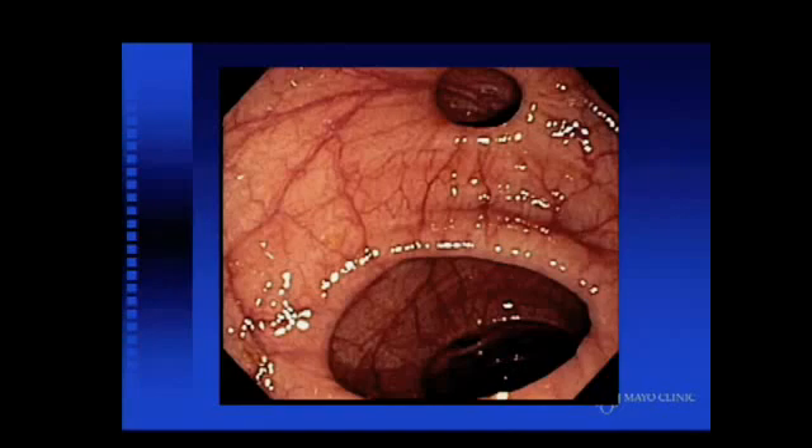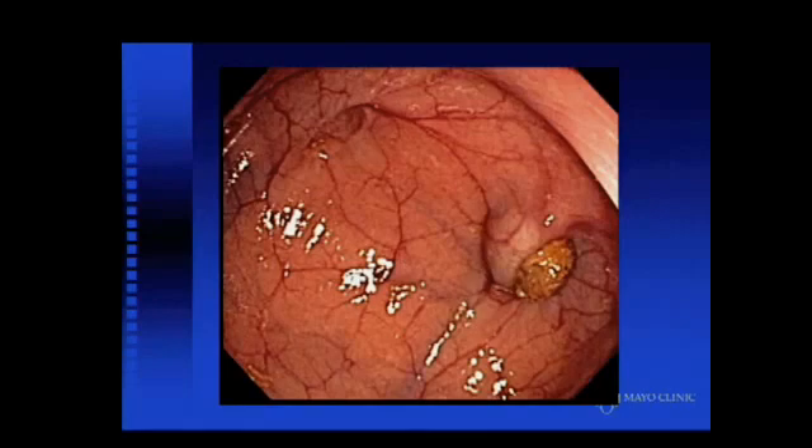In the sigmoid colon you encounter the first diverticula. It's important to stay with the lumen of the bowel and not try intubating the diverticula themselves, which can be difficult in a patient with multiple diverticula and a spastic colon where it's difficult to differentiate between the lumen and the ostium of a diverticulum. Stool balls within diverticula are almost pathognomonic for diverticulosis. A little bit of slide-by is acceptable as long as the patient is comfortable, but excessive slide-by can introduce loop formation that's difficult to deal with later.